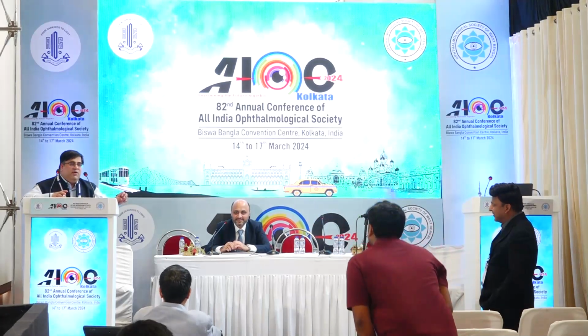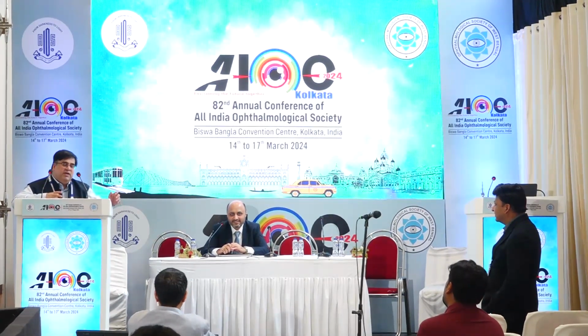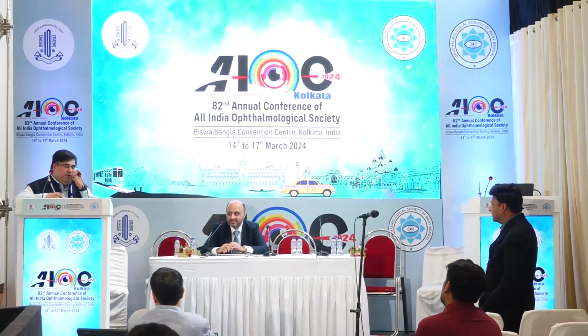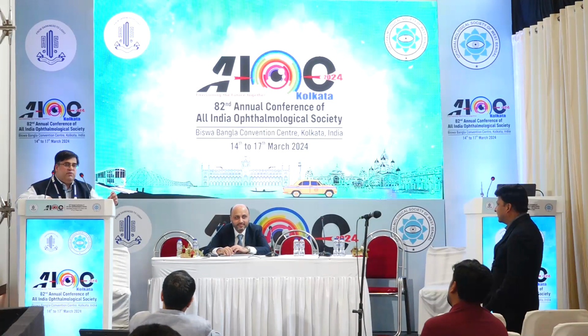If the amount of blood is not too much, I would ask for strict prone positioning. Try and see if that blood over the next 1 week moves away from the center. If it is away from the macula and the patient is okay with it, I will wait and probably tackle it later with oil removal. If it starts to organize on the macula, then I would go in for an early evacuation, within 2 weeks.